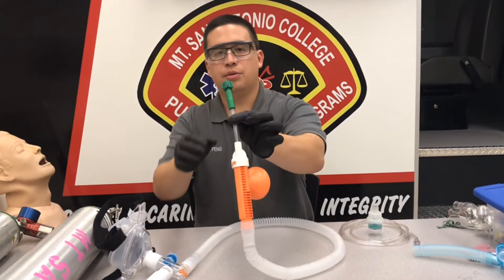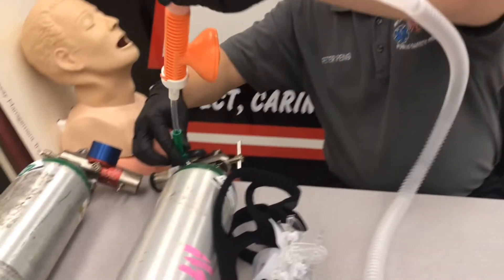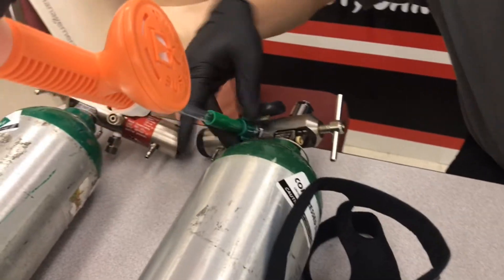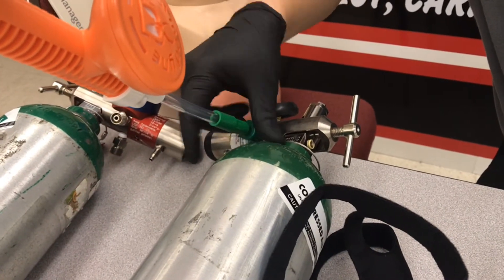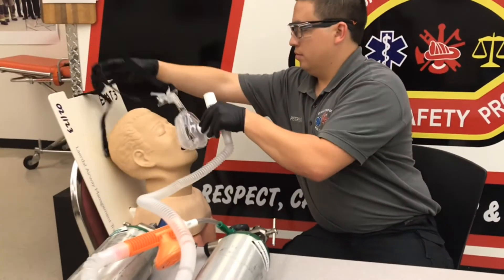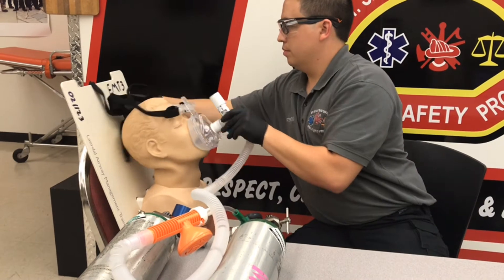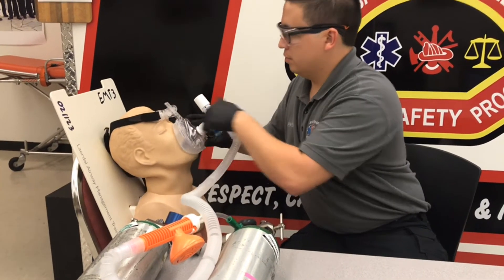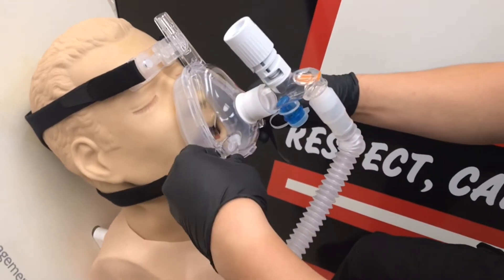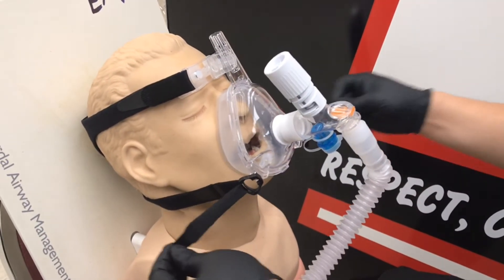Next we're going to hook this up to the first oxygen tank. Make sure it's nice and tight. Now we're going to attach this to the patient. We're going to clip these on and take these straps and tighten them down.